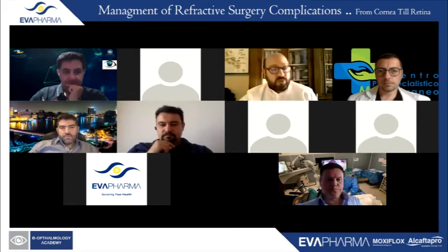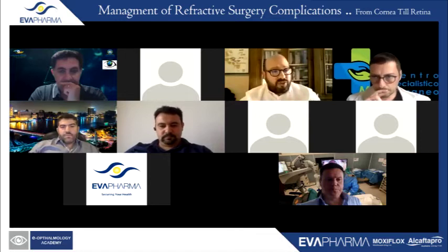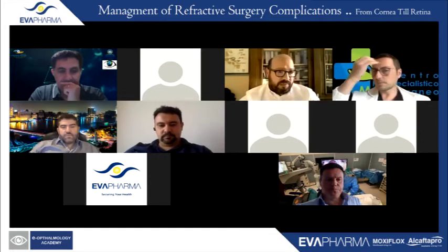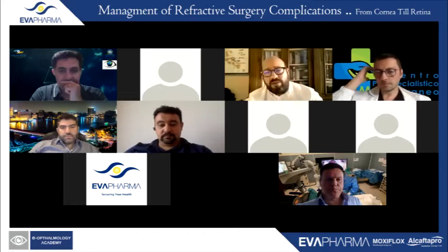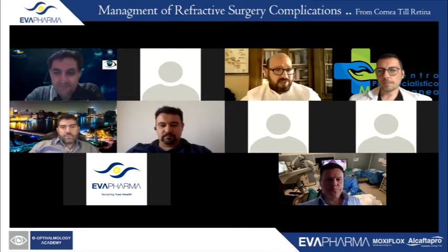Yes, we have completely changed the protocol. I think Miguel will speak about this in his topic, because we don't need to use 30 minutes of corneal soaking with riboflavin. We avoid dextran solution. We use hydroxypropyl methylcellulose. We do only 10 minutes of corneal soaking, without dextran. We don't use the Dresden protocol, never for these treatments. No 30 minutes of UV continuous light, because we may have haze.